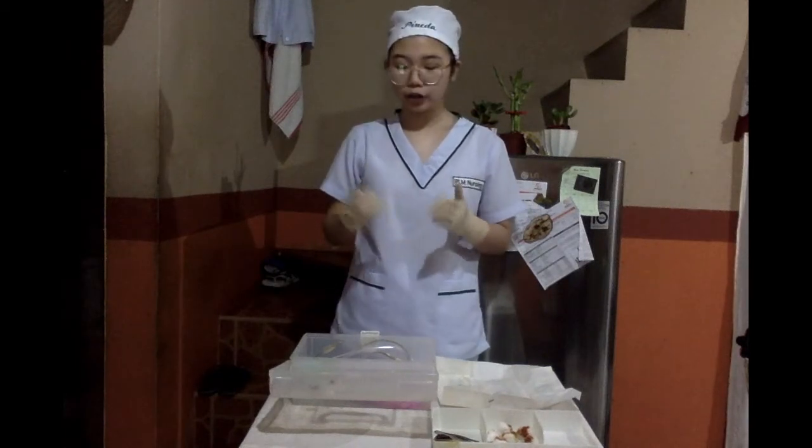So for male patients, the catheter is lubricated 6 to 7 inches from tip down. Examining the catheter tip prevents the use of a damaged catheter. We also lubricate the catheter tip to promote ease of insertion and avoid irritation of the meatus during insertion.